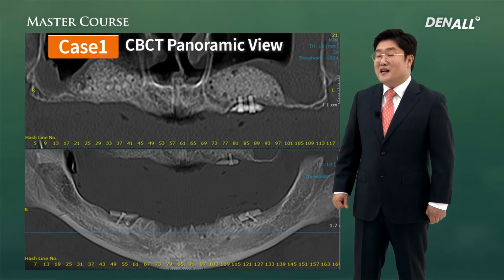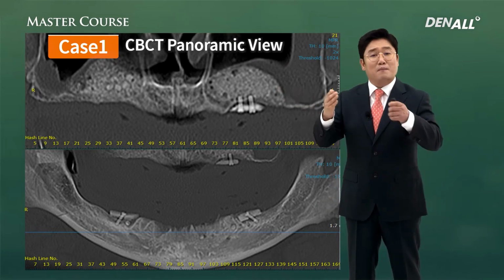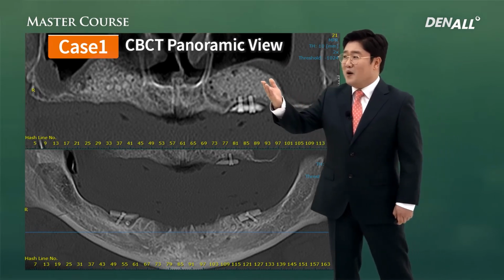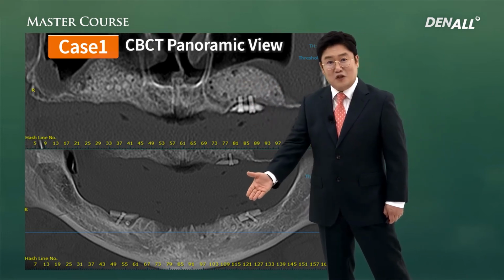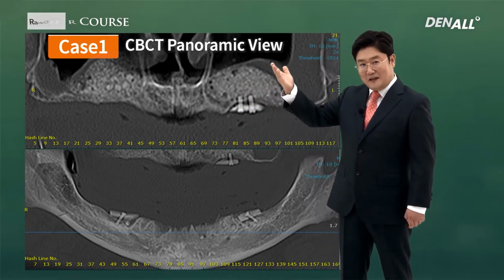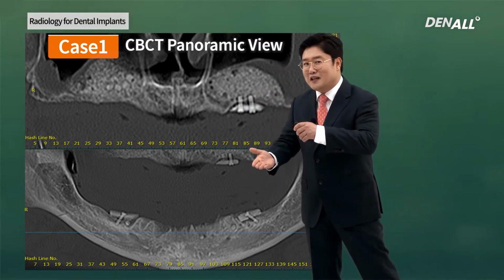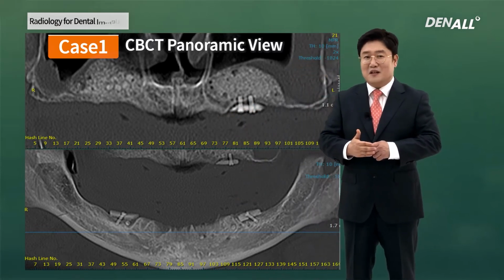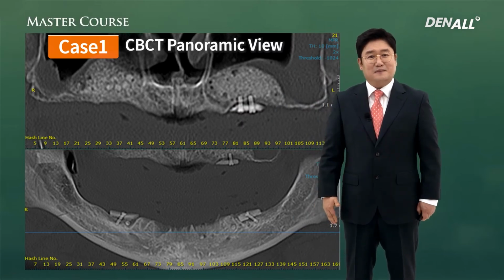Cone beam CT cuts have been recomposed for panoramic view. So the panorama view is made of CBCT cuts. The graft positions and amount can be checked. Important anatomical structures, the status of the sinus and inferior alveolar nerve, the location and its relation with other structures can definitely be checked with the CBCT.